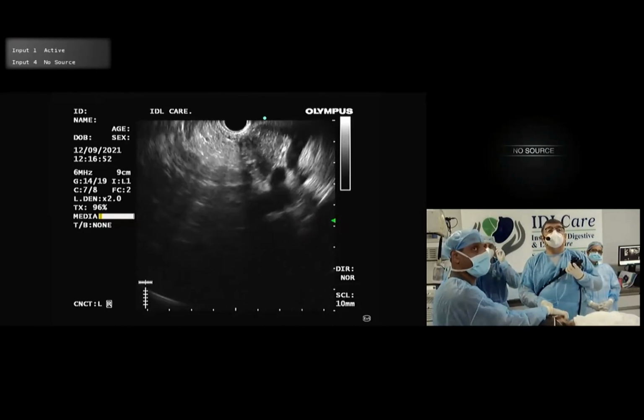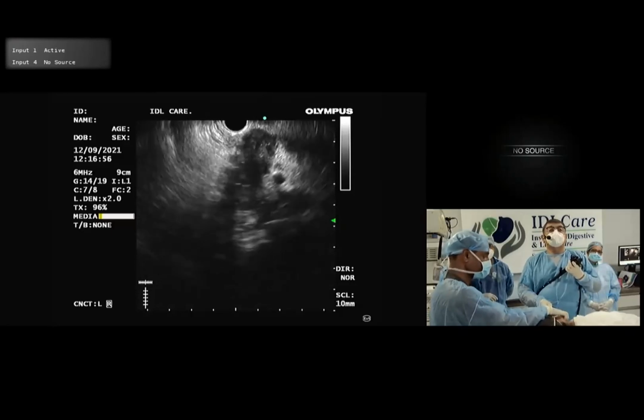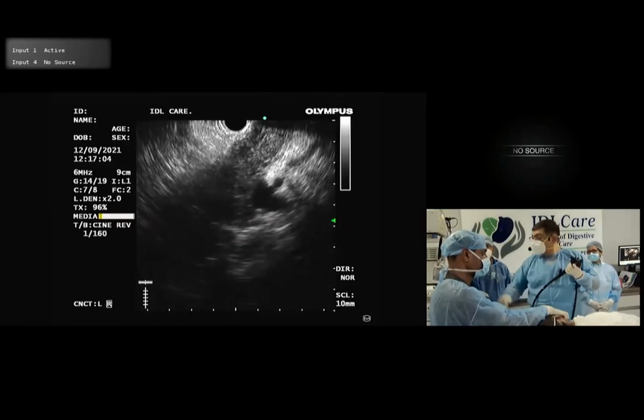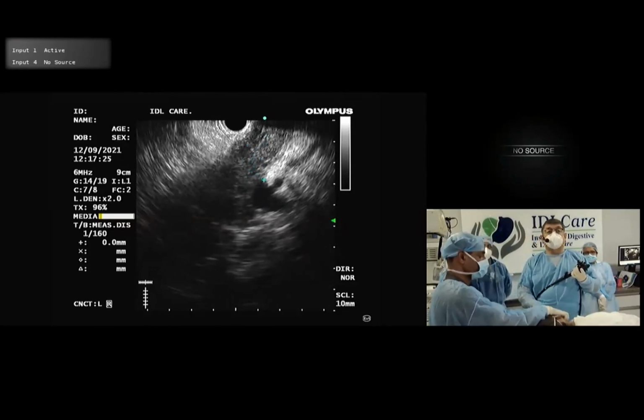And this lesion is, you see, I'm using extreme up now to see what is happening. So, a little knowledge of the anatomy. This is the portal vein coming. This is the splenic vein. So, if you see the neck of the pancreas, this pancreas is also not normal. It appears edematous, heterogeneous, and bulky. So, even the neck and body region doesn't look normal.